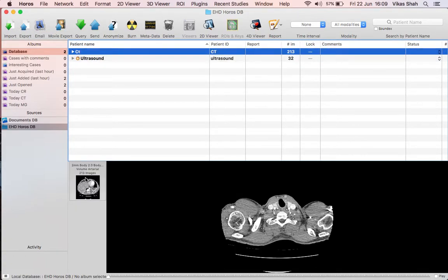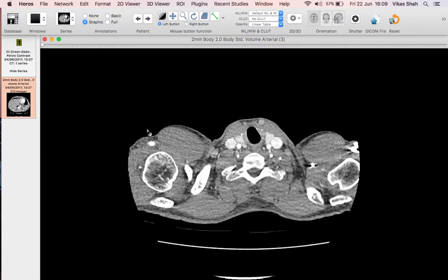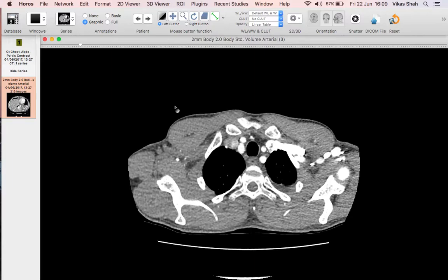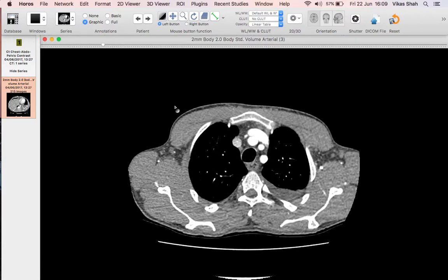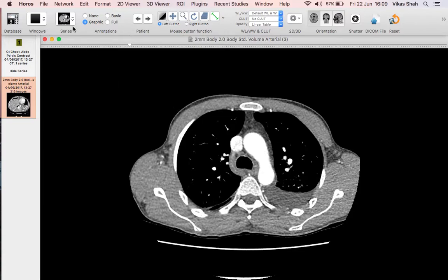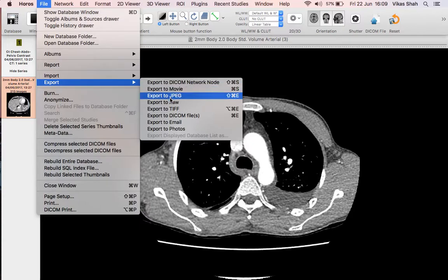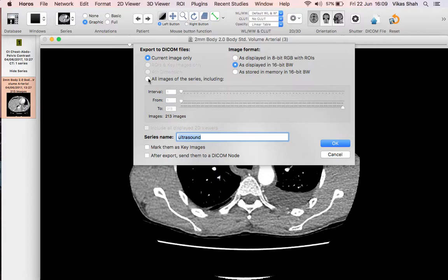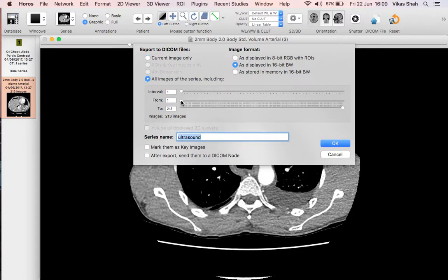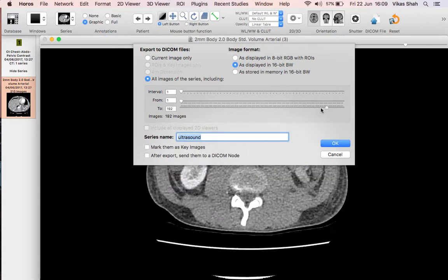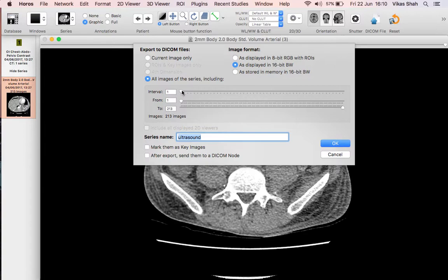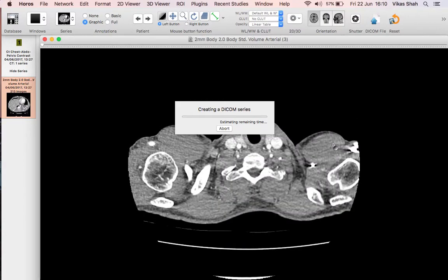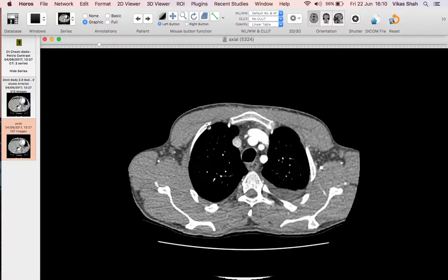A couple of other tips and tricks for CT. Often when we get images off CT scanners, because of how thin the slices are, you can have hundreds of images — this axial stack has 213 images. That makes some studies in Radiopedia quite slow to load, and it's not really necessary to have so many. You can reduce the number of slices by going to Export and DICOM files. Select all images — you can trim top or bottom slices using the from and to sliders, and reduce the number of slices by increasing the image interval. Setting it to two reduces the images to 106, so calling it 'axial' and clicking OK creates a new series with 107 images.